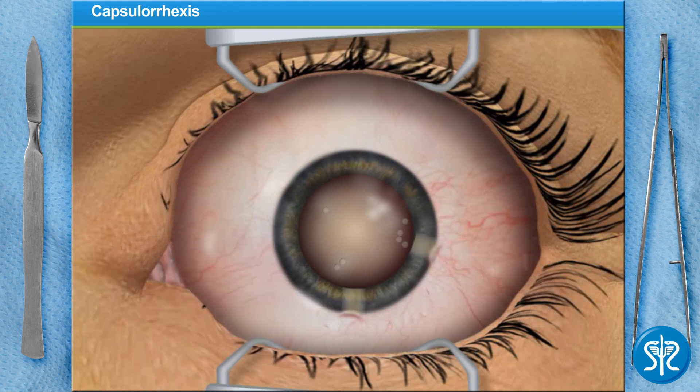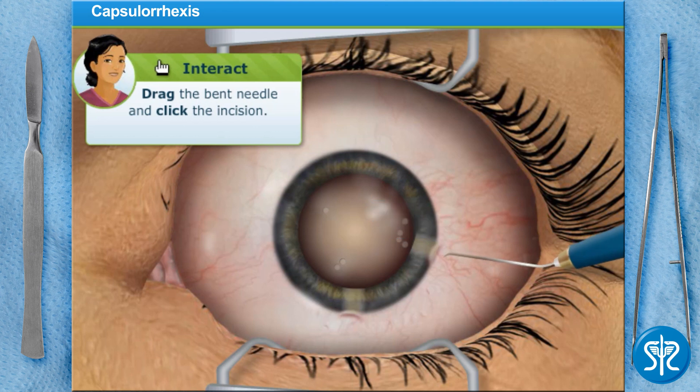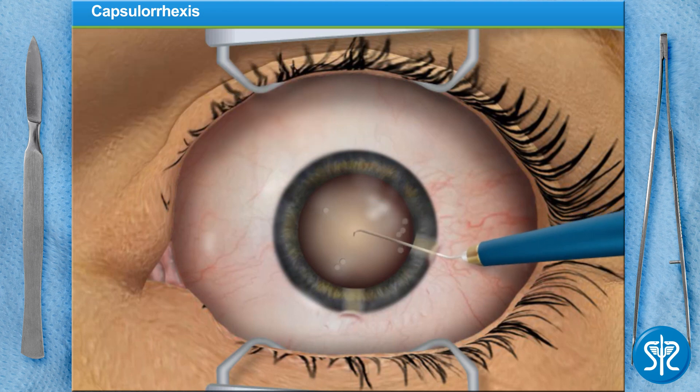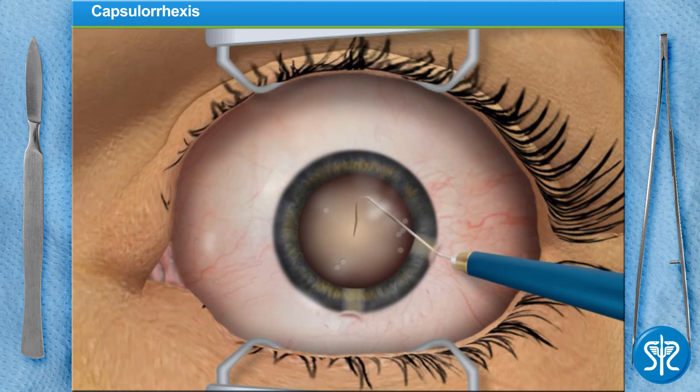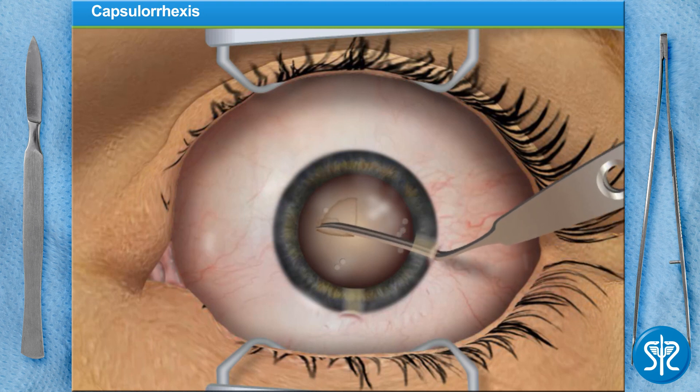A bent needle is inserted into the incision and used to poke a hole into the clear sac that holds the lens with the cataract. The needle is dragged to cut a line in the sac. With the incision made, we'll insert the forceps to grab the torn sac and tear a circle out of it.